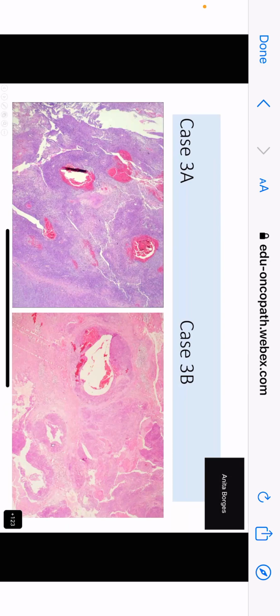There are other spaces, right? Yes, there are multiple other spaces. There are spaces, some with blood in it and others not. And you also see some spaces that are almost like cracking artifacts in the tissues. You see that here? You also see on this side.